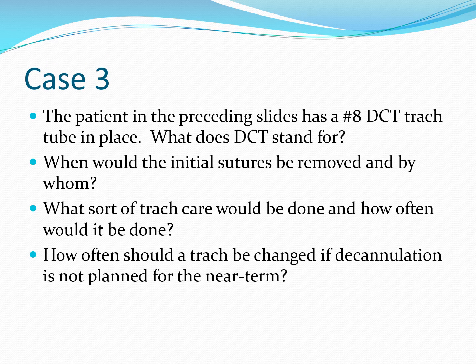The patient in the preceding slide has an 8 DCT. So this is a little bit like Jeopardy for tracheostomy tubes. What does DCT stand for? And again, there was an early slide in this that basically talks to it: disposable inner cannula, cuffed tracheostomy. So it's cuffed. It's, by the way, one of the most common tracheostomy tubes that's actually used.